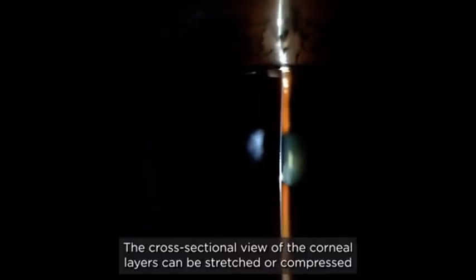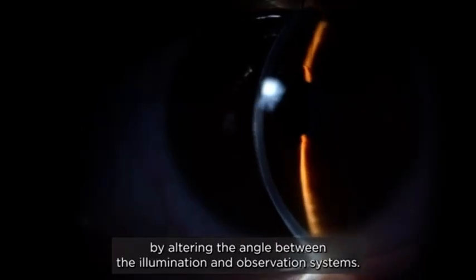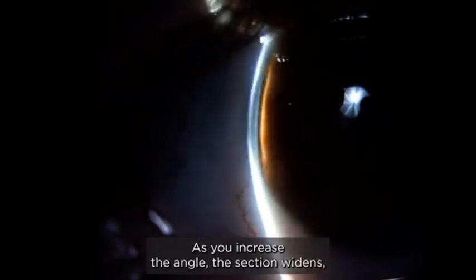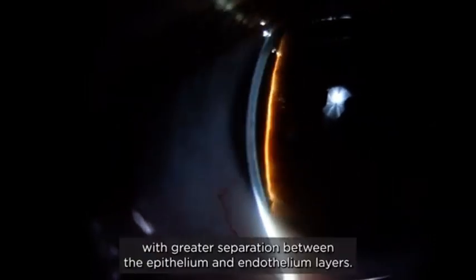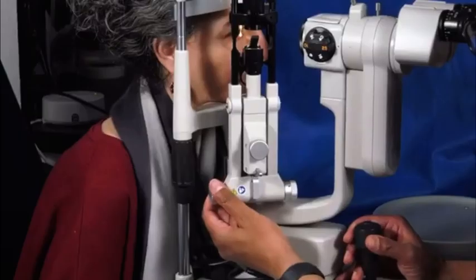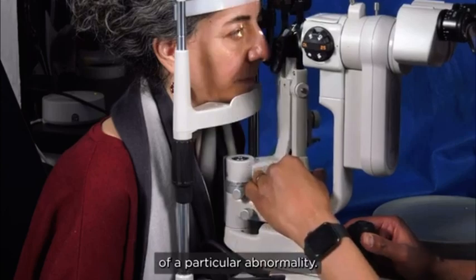The cross-sectional view of the corneal layers can be stretched or compressed by altering the angle between the illumination and observation systems. As you increase the angle, the section widens, with greater separation between the epithelium and endothelium layers. This is useful when trying to determine the depth of a particular abnormality.